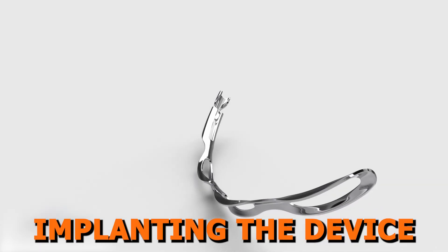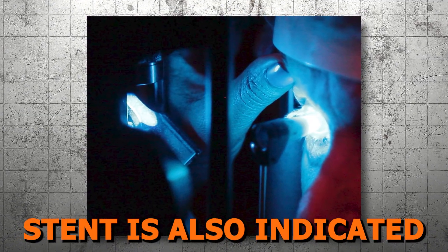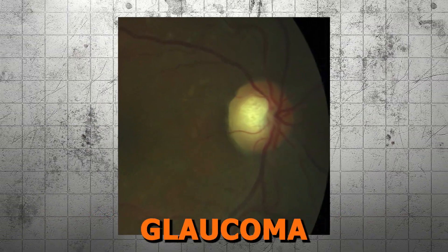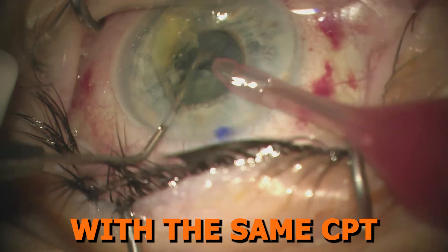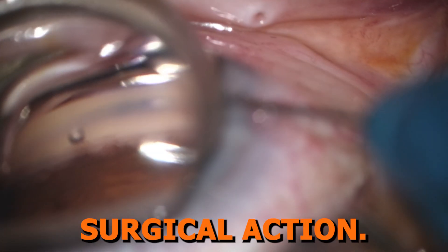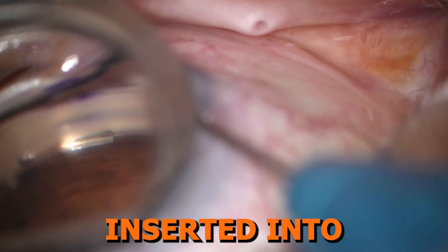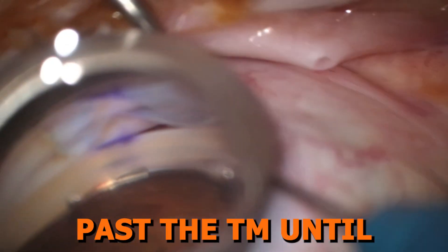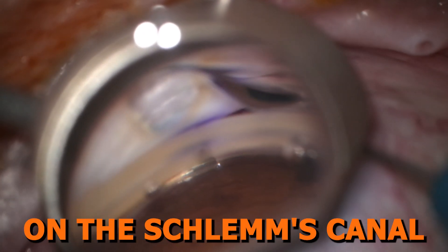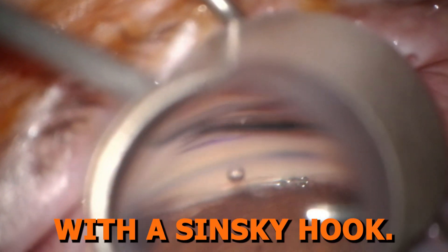One does need to avoid implanting the device in people with nickel allergies. Like the first and second generation iStents, Hydrus Microstent is also indicated for the reduction of intraocular pressure in adult patients with mild to moderate primary open-angle glaucoma in conjunction with cataract surgery with the same CPT codes. It is not available in the U.S. as a standalone device. Here is the Hydrus Microstent in surgical action. After making a small incision to create a goniotomy for entry, the Hydrus stent is inserted into Schlemm's canal, past the TM, until it's well inserted at the tip. Then the wheel of the inserter is dialed to implant the Hydrus into the nasal quadrant of Schlemm's canal, and then the inserter is removed. The implant can be nudged into position if needed with a Sinski hook.